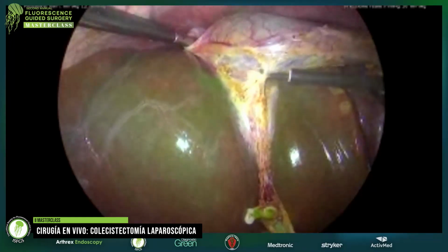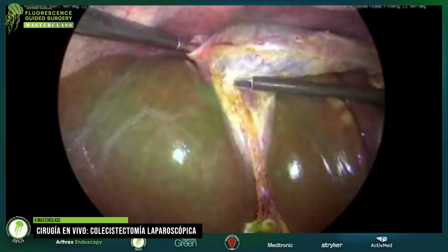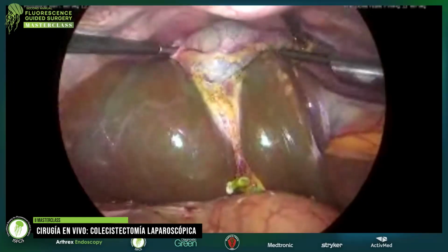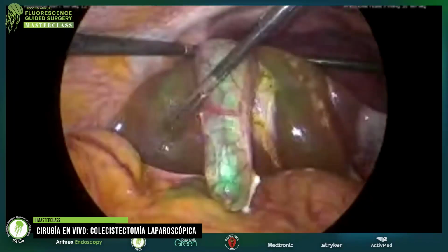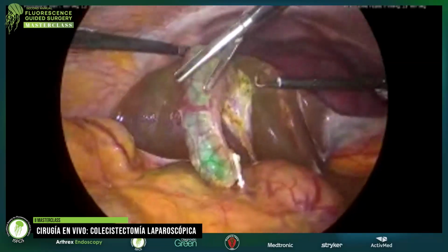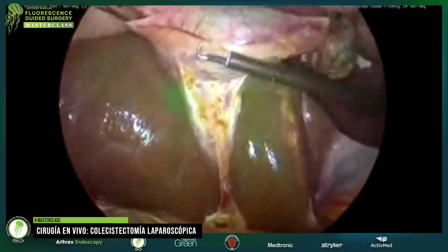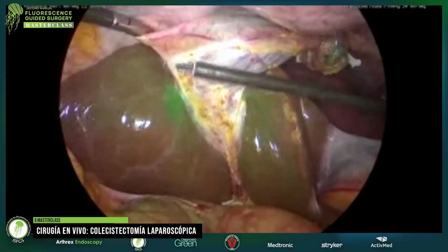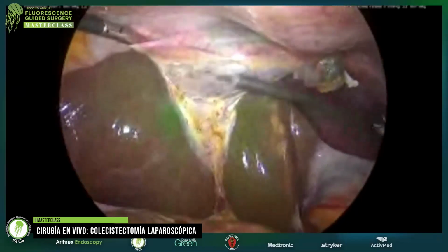And regarding the use of ICG during laparoscopic cholecystectomy, actually we use it for all cases. Sometimes when we do congress courses, a lot of people say that it's useless for elective cases, but you never know when you can be in trouble or when you can have some accessory duct. Yesterday we were doing a quite simple case regarding the history, and there was a big accessory duct just behind the cystic duct. Yeah.